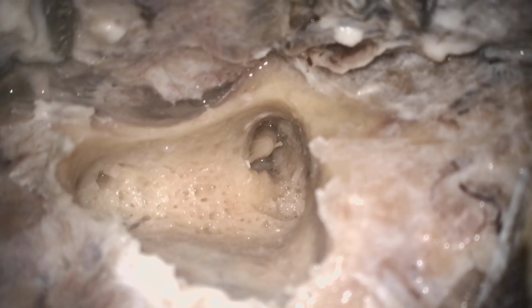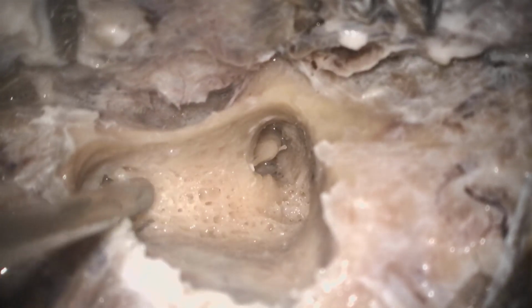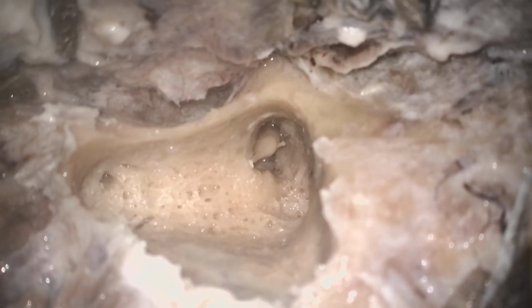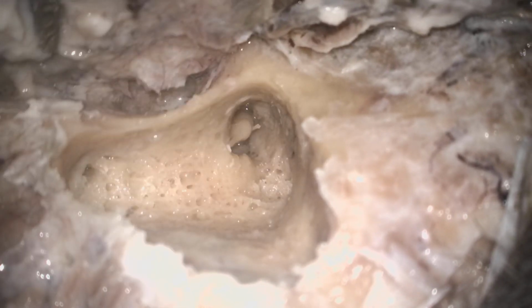We have exenterated all accessible cells over here. Definitely we can drill so far in the mastoid tip area. We have to go far inferior, but before that we will drill this ridge area and we will define the posterior tympanotomy, how it is done and how to access the middle ear through the mastoid antrum without opening your tympanic membrane.